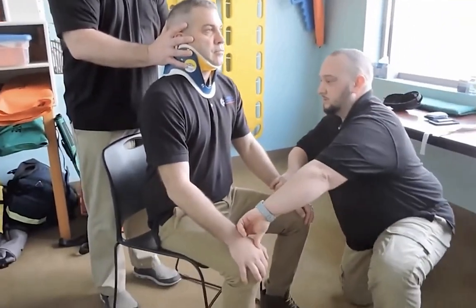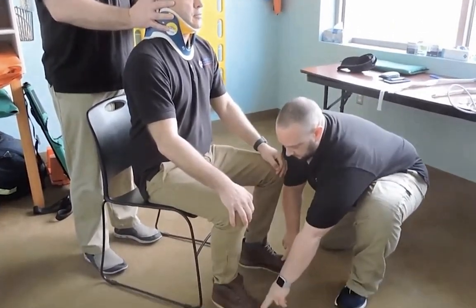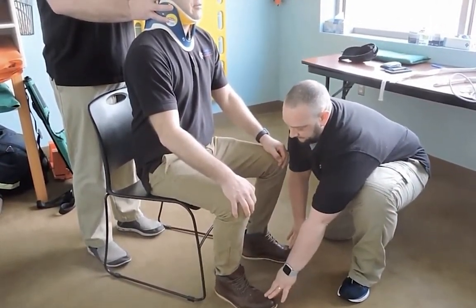I'm going to come and check again for radial pulses. Sir, can you still feel me touching you? Yes. Same on both sides? Yes. Squeeze my hand? All right. I'm going to check for pedal pulses. You feel me touching you? Yes. Same on both sides? Yes. And can you wiggle your toes? All right.